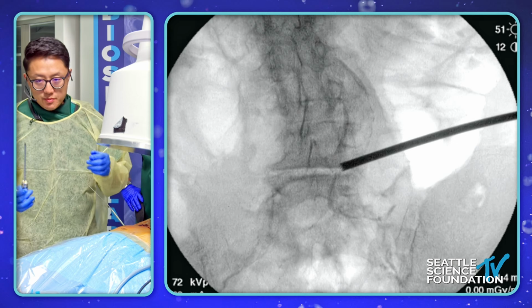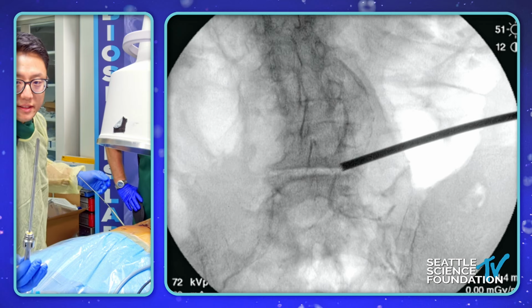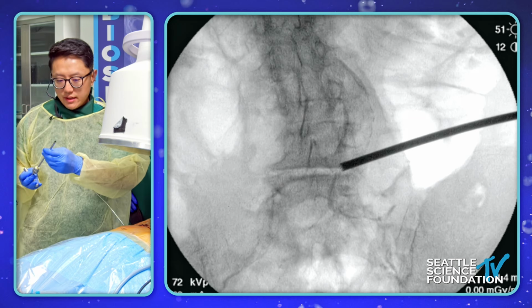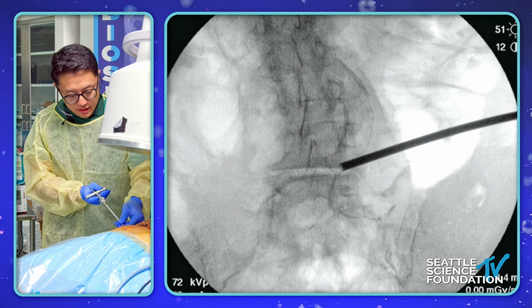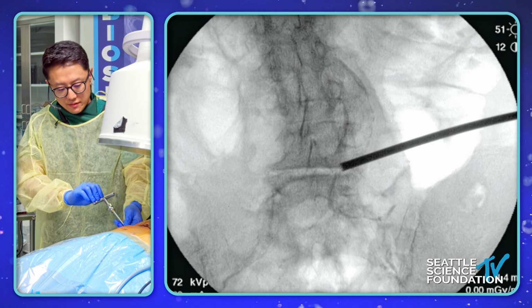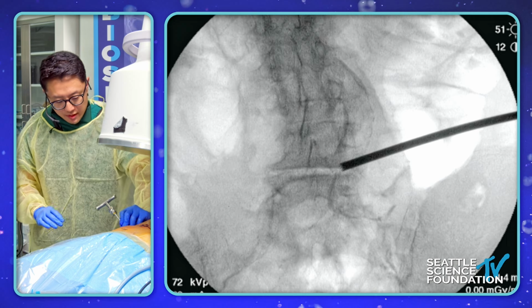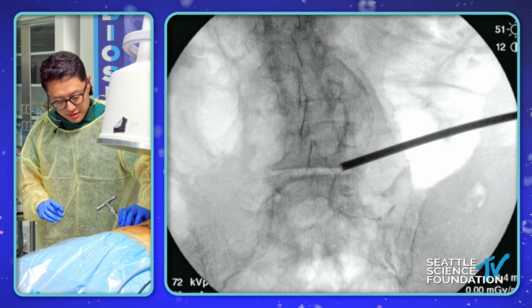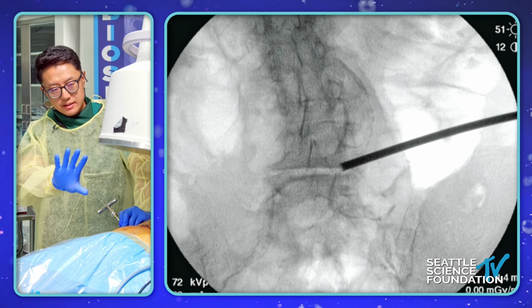Let me just pause for one second and show you this crown reamer. I don't know if you guys can see this, but the way these reamers work is that they don't really cut when you turn counterclockwise. They only cut when you turn clockwise. As you're putting this in, you generally go counterclockwise to get through the soft tissue, and once you land on bone, then you can start the reaming process. Going back to your question, at this point I'm doing two things: one, applying forward pressure, and two, as you alluded to, applying a little bit of downward pressure to lever into the SAP.